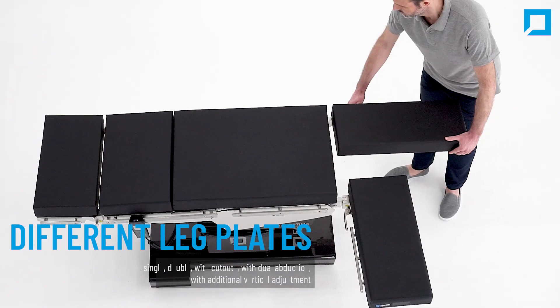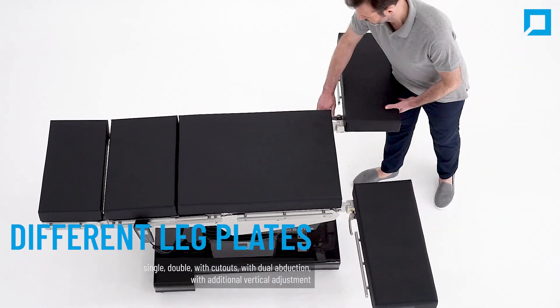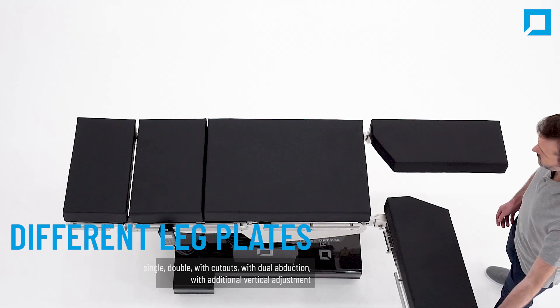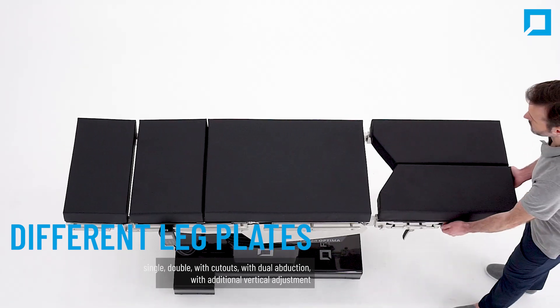Different types of leg plates are available. Choose between single, double, contoured, or dual abduction plates, or install a leg section with additional vertical adjustment.